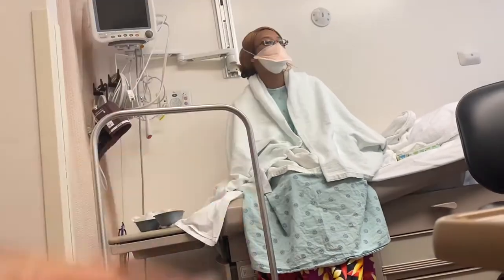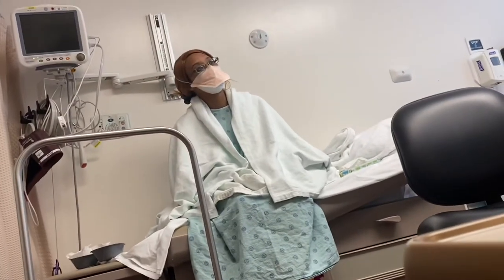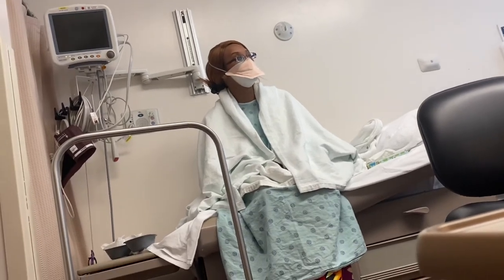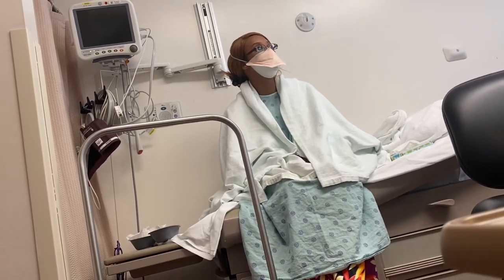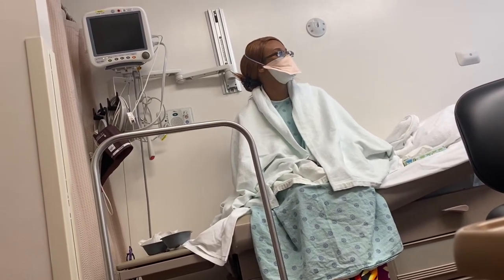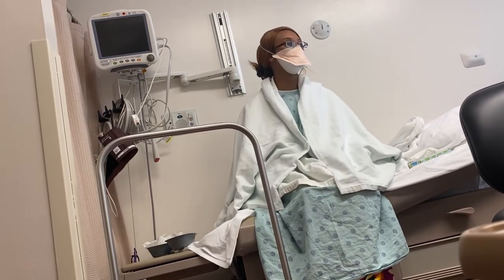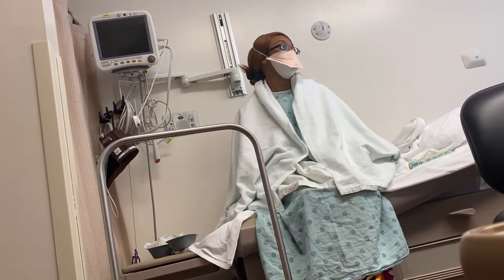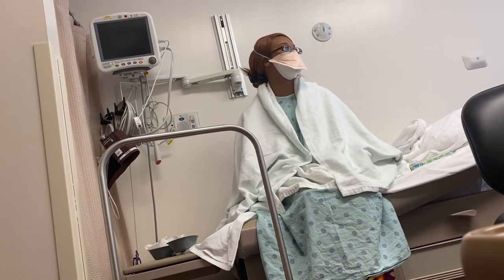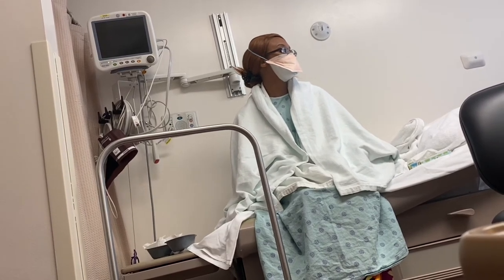Will this cause the gagging effect too? Yeah, you might gag again. It's smaller, but you might gag. Can you tell whenever it's going? When it's reached what part does it start to gag? Yeah, right here at the back of the throat is where it starts. Okay, back of the throat. And I can tell by your behavior, and I can see when it gets to your stomach, I'm going to look for an acid number.